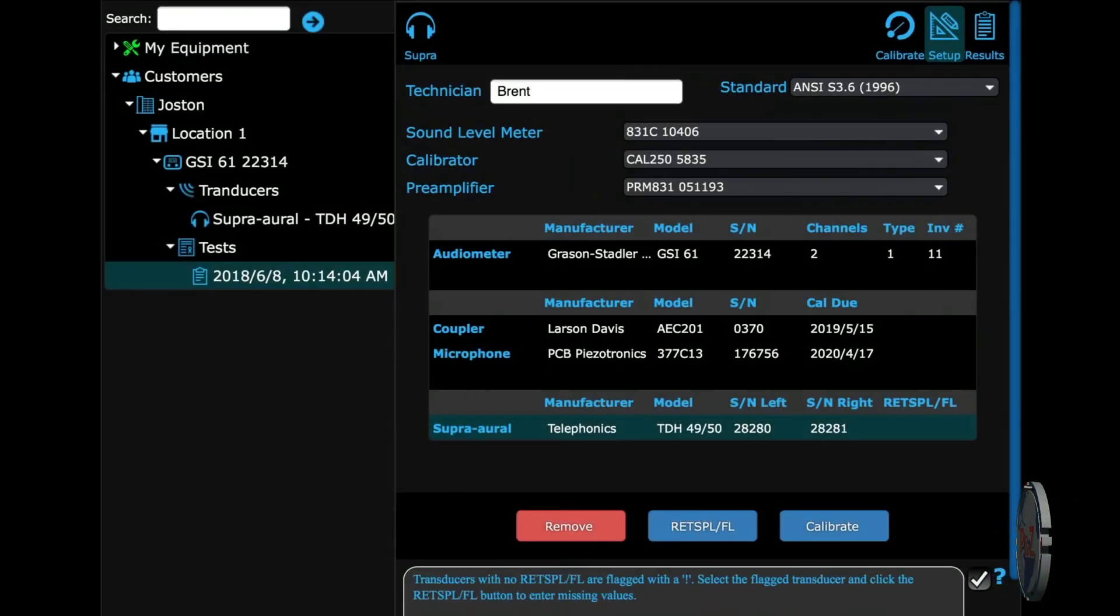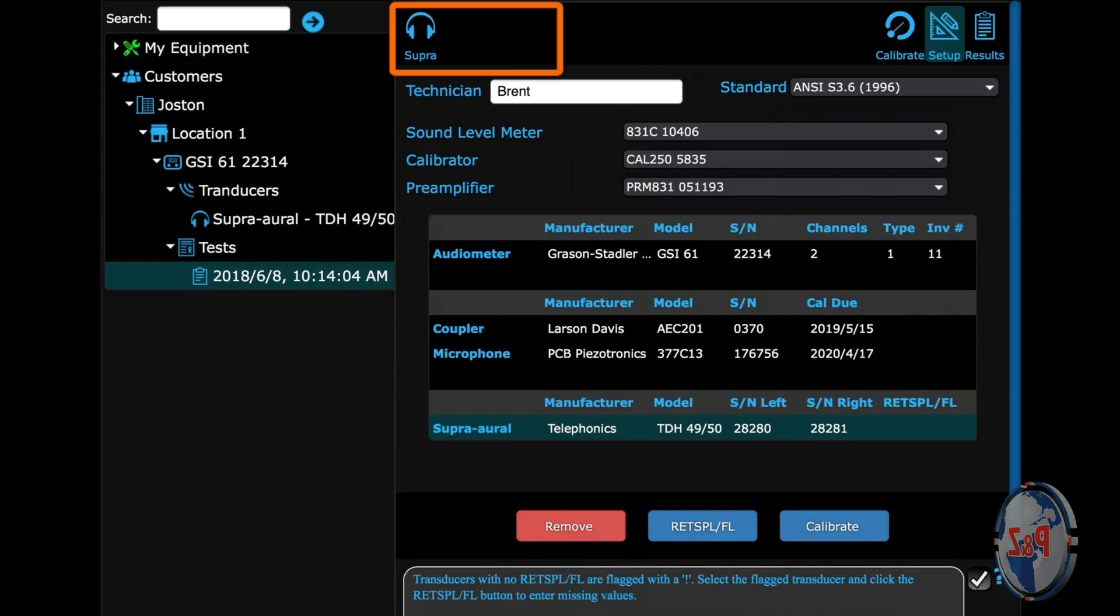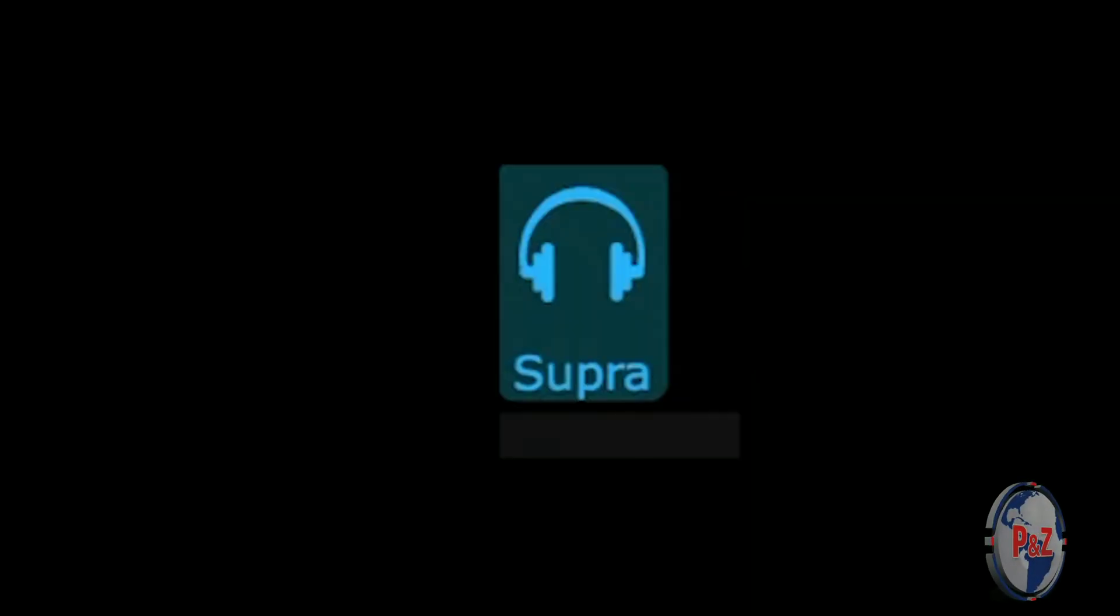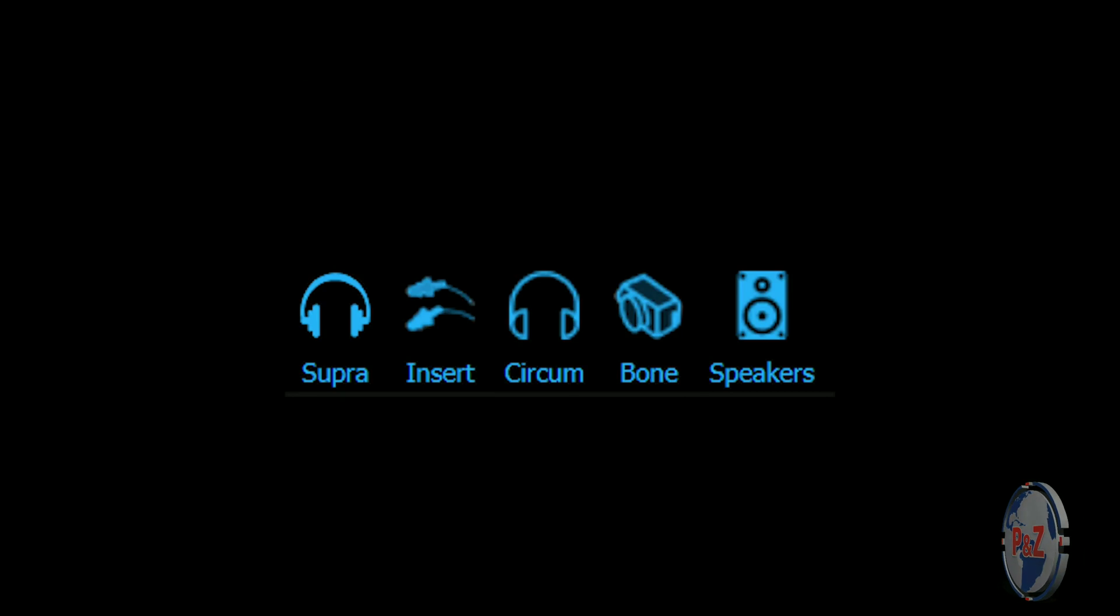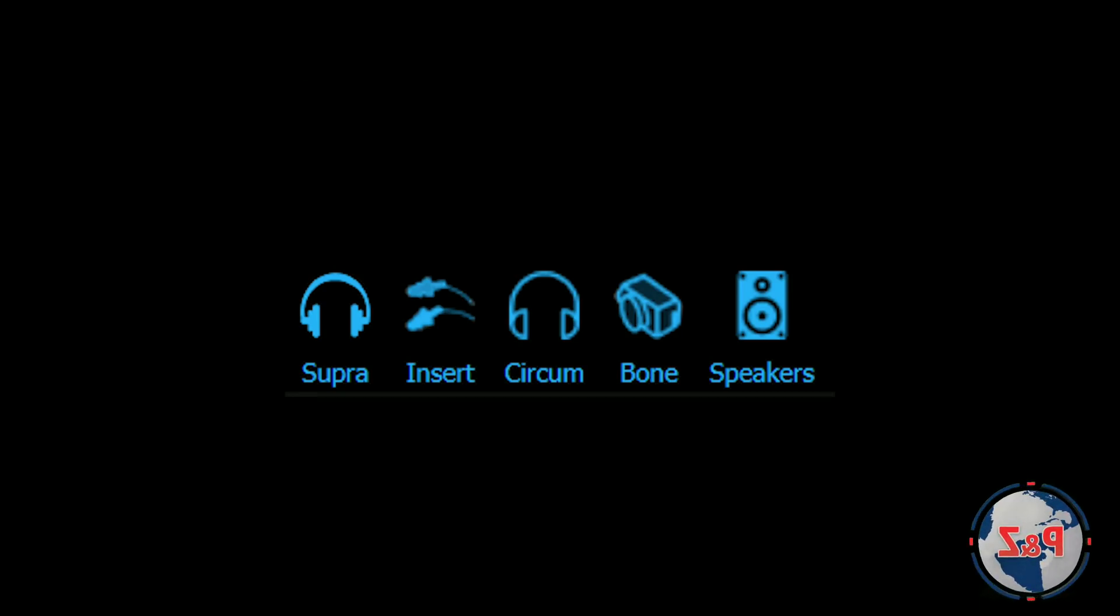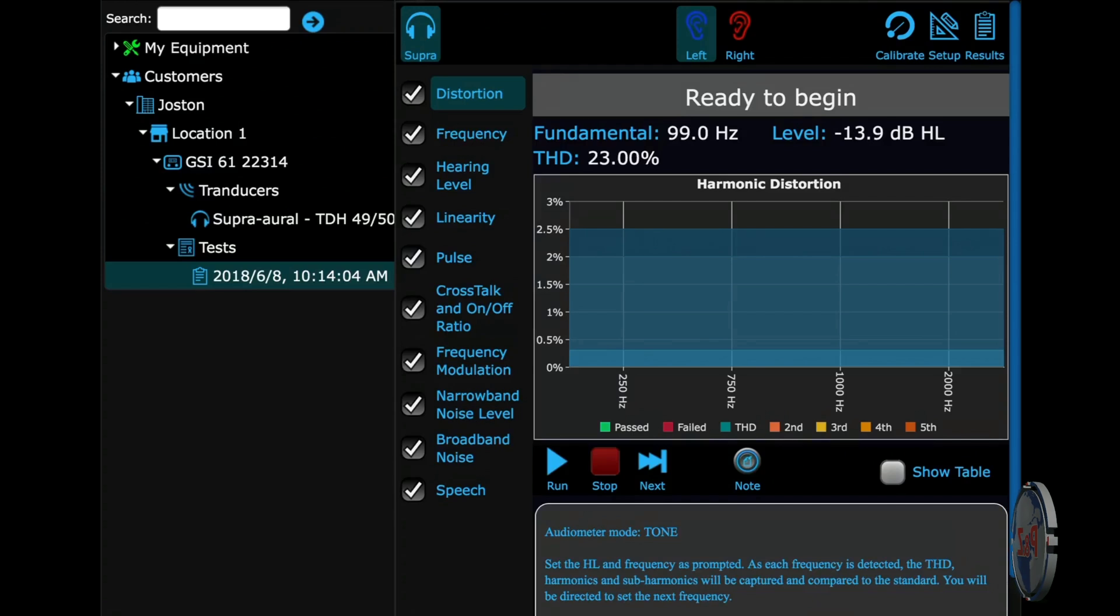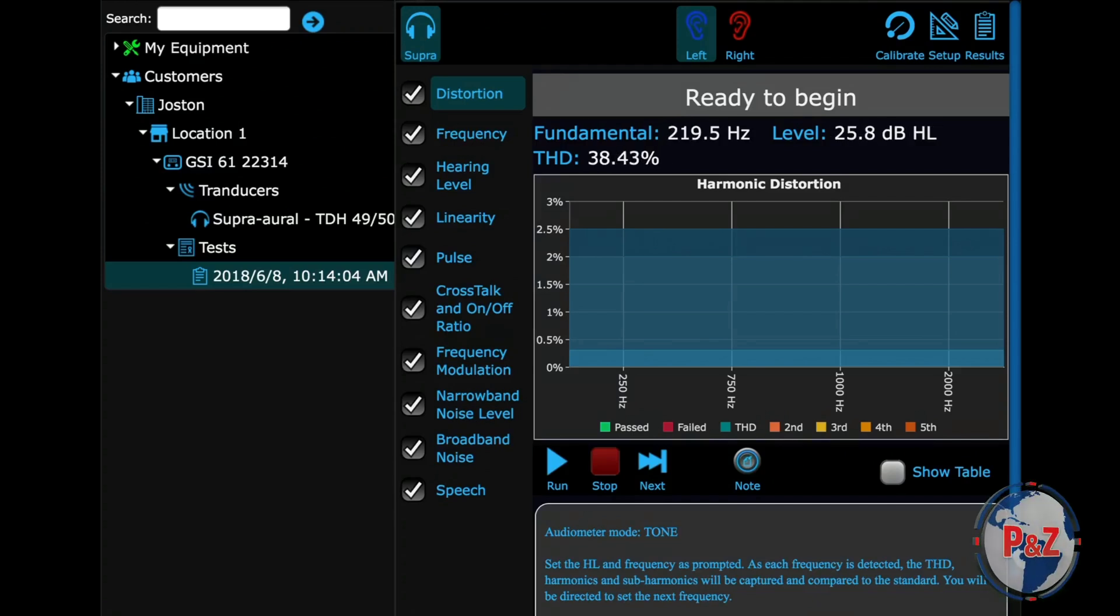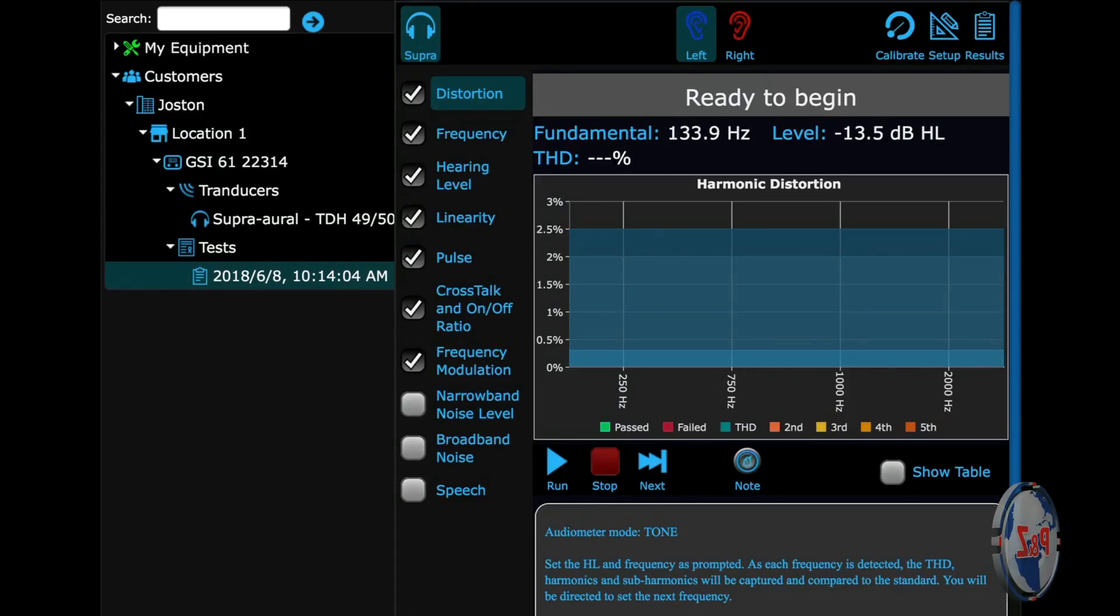To begin running a test, have the test you created selected in the tree view, then select the transducer icon you want to test first. Here we only have one, so it makes it easy. If you had other transducers, they would look like this. We can run any of these tests in this list. The checked ones are going to appear in the final report. We're not going to run these last three ones today.